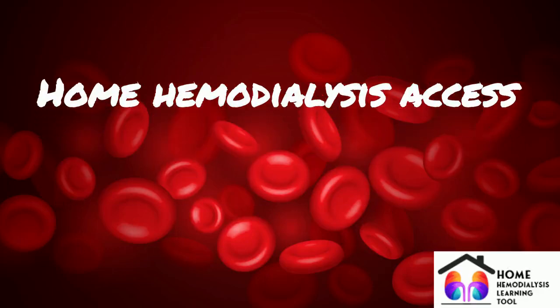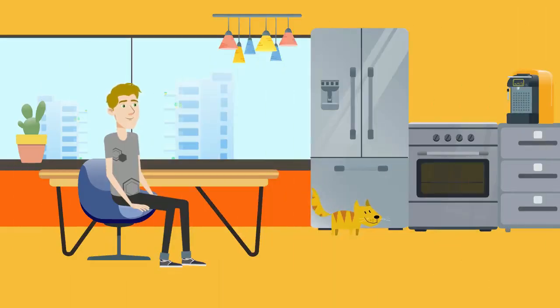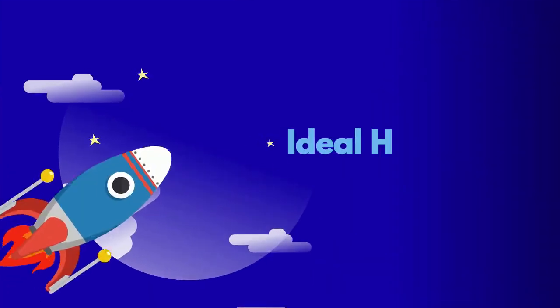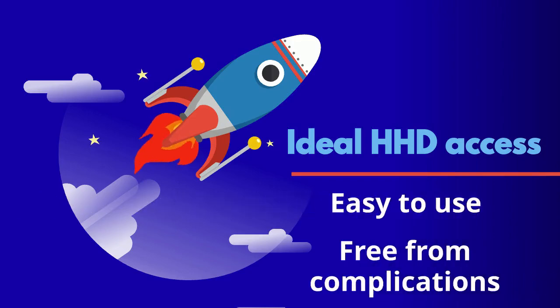Hello, let us review home hemodialysis access options. As the sole responsibility of frequent cannulation and connecting to the home hemodialysis machine relies on the patient, it is important to consider the patient's individualized choice for home hemodialysis access. Ideal vascular access for home hemodialysis should be easy to use and free from complication.